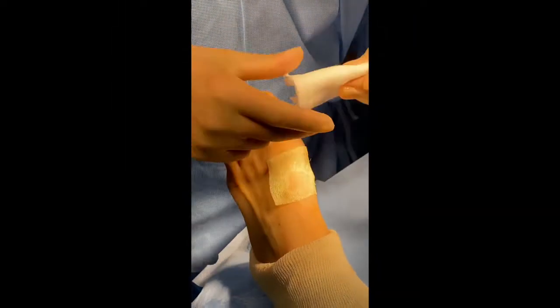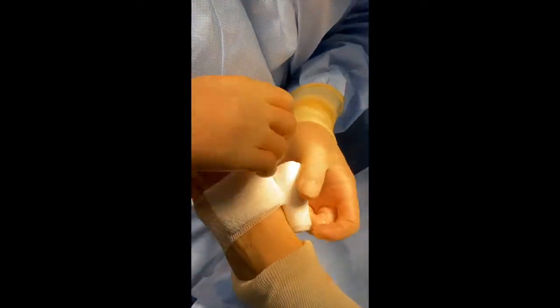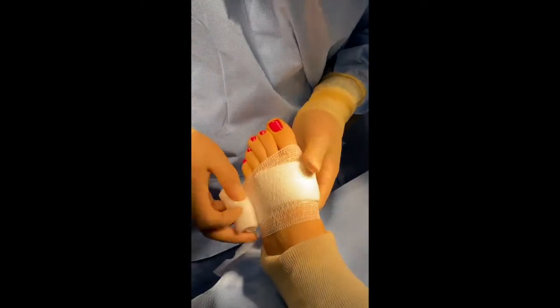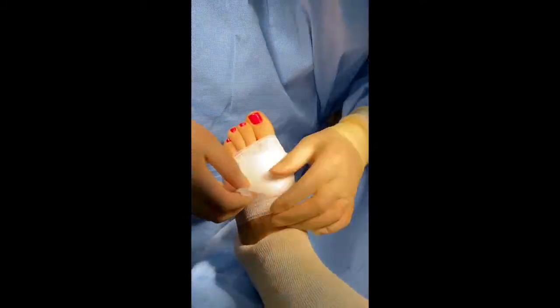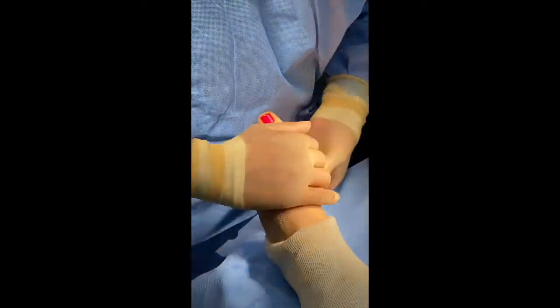The following day the patient will be able to remove the bandage and place a band-aid over that spot and get back to wearing any shoes that they wish. The patient's foot was previously numbed — they are sedated right now and will be awake in a matter of two minutes.